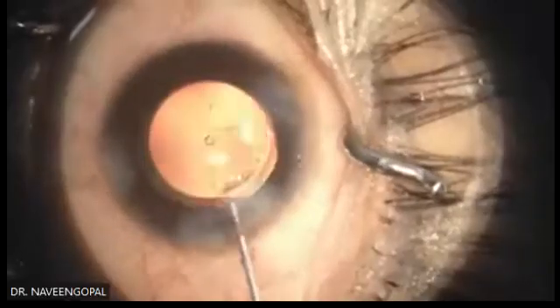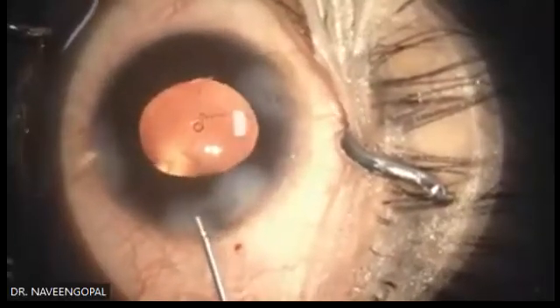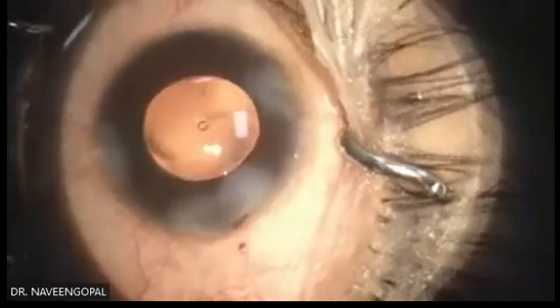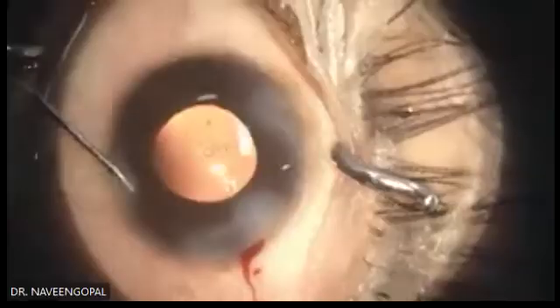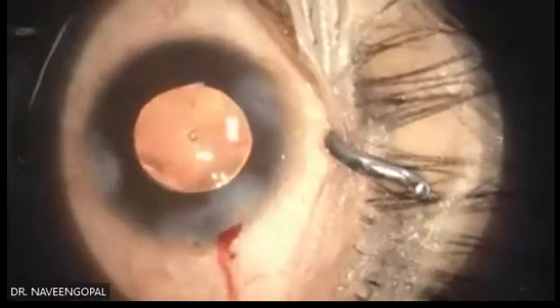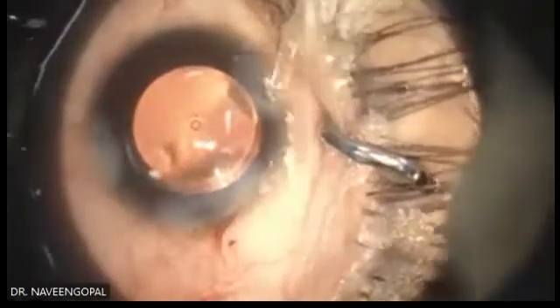Just wash finally whatever is there in the AC. Now we are done. Post-op care, I think you know, but I myself and Dr. Raghu both will repeat. For your benefit, I keep my patient 1 or 2 hours after the surgery. I check the IOP. If the IOP is high, I give a couple of Diamox after the surgery and send.